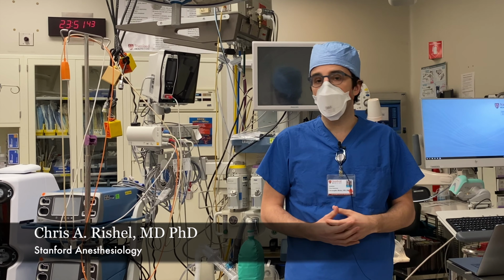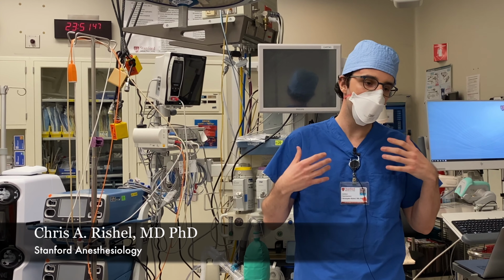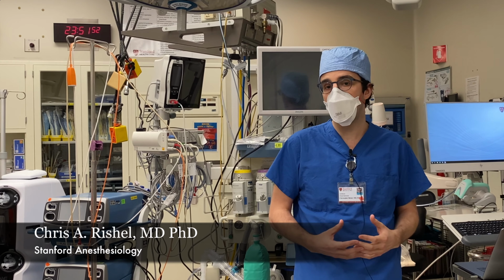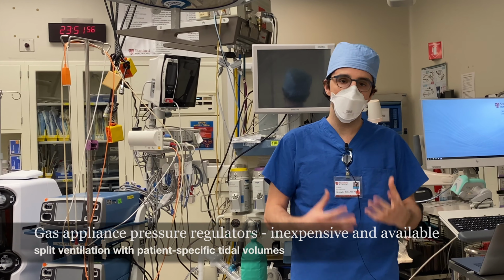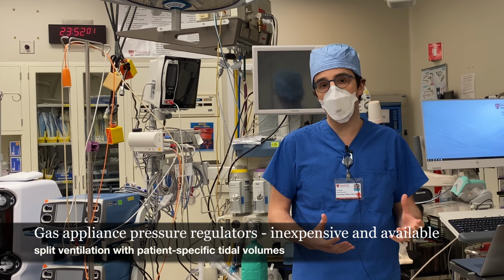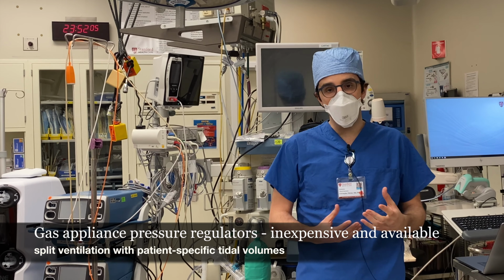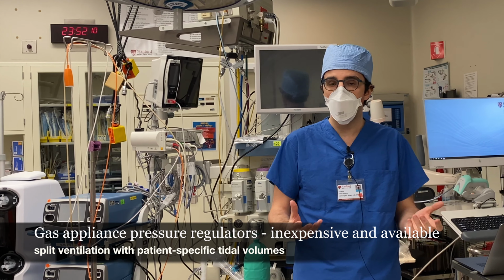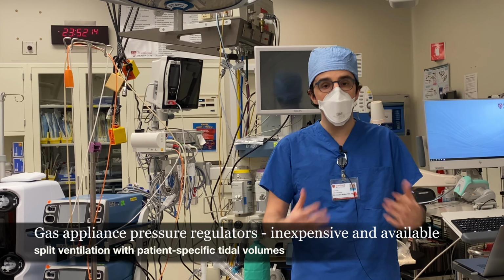People try to do this in desperate situations and try to match patients as closely as possible in terms of their size and pulmonary mechanics, but there are a lot of reasons why this can cause problems. We've been working on a solution to this using pressure regulators, which is an off-the-shelf technology that's used in a lot of different industries that, with the way that we've developed to put these things together, can help independently control the ventilatory mechanics for each patient to improve upon the passive standard and make this technology potentially safer.